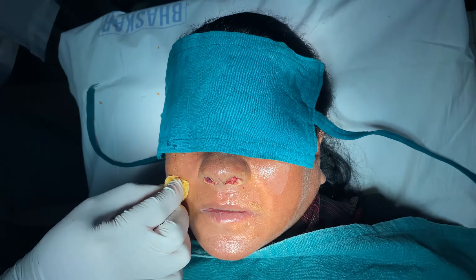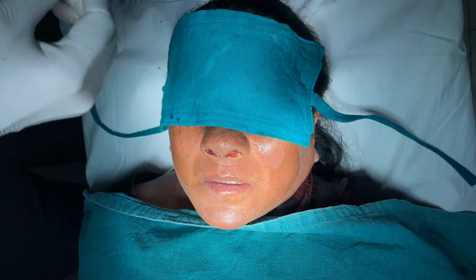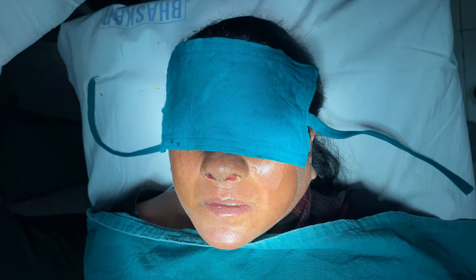Patient compliance is very important. Once we try to put Savlon like this, it is very simply and easily removable.